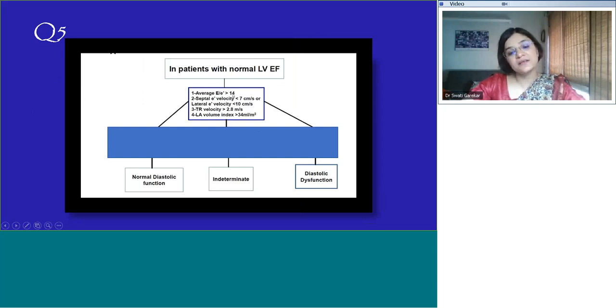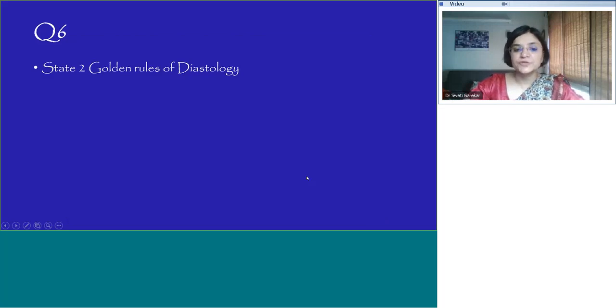So you can look at these numbers for adults, and for pediatrics, try and use your charts. Then you are in diastolic dysfunction range.